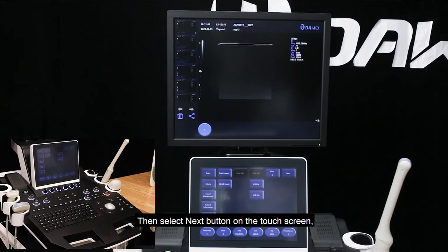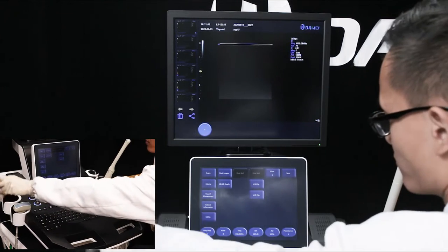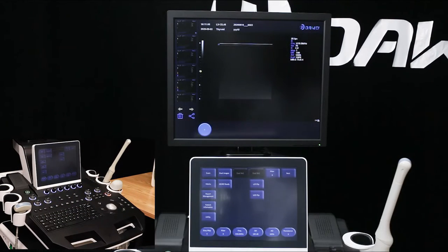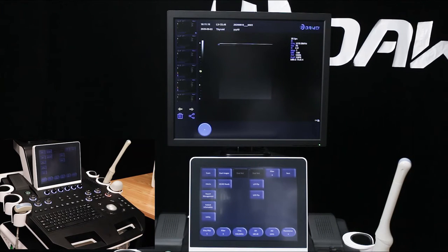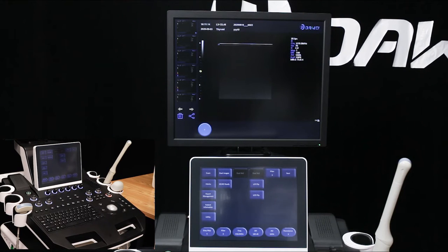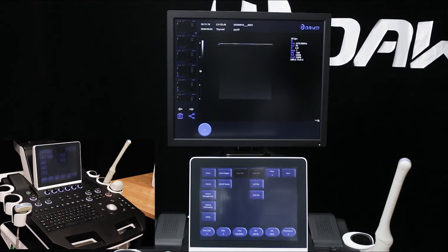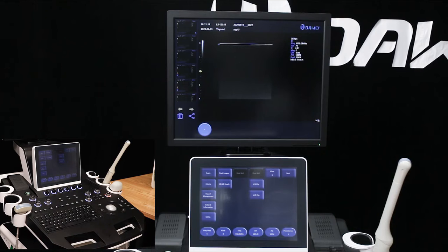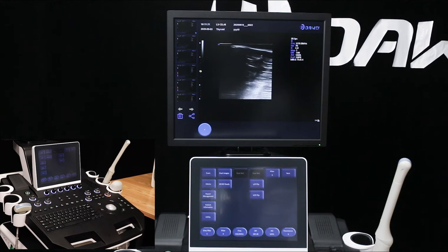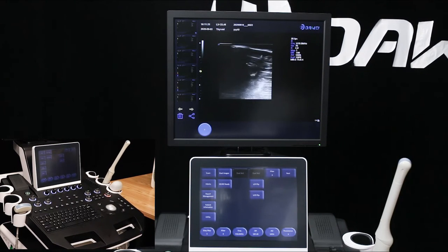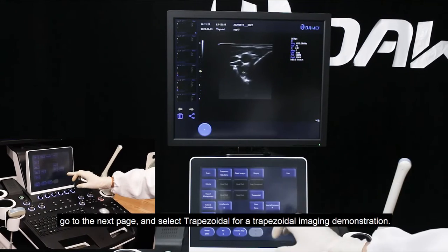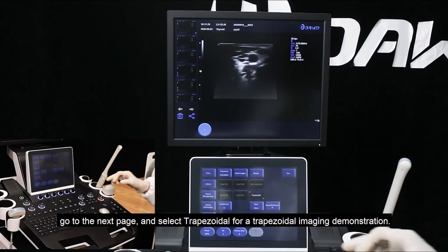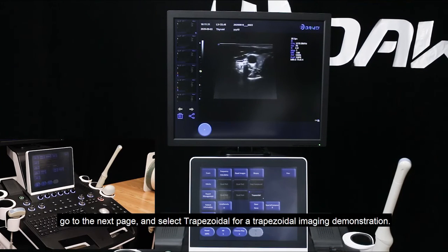Then, select the next button on the touch screen. Go to the next page and select trapezoidal for a trapezoidal imaging demonstration.